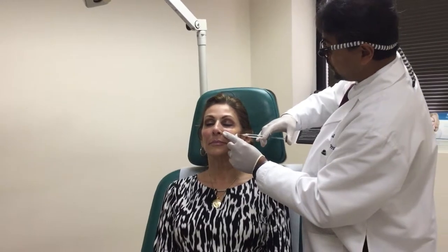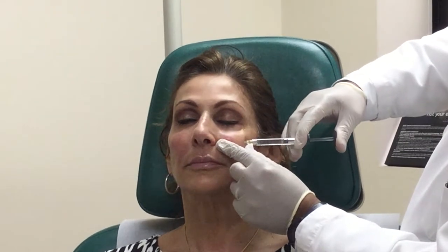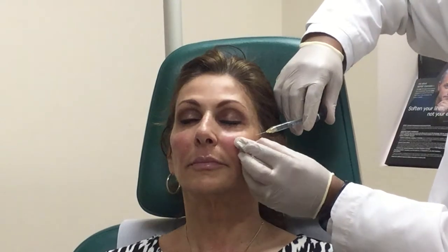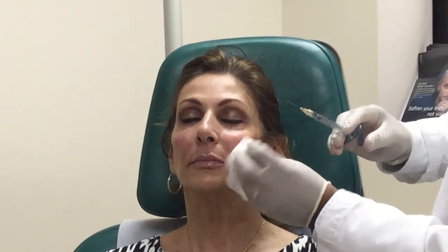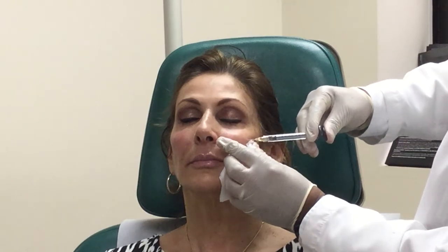Now we can go to the other side. It's obviously important to do the same thing on both sides, unless somebody's asymmetric to begin with — those are things you have to look at before you start injecting. Nobody wants an unhappy patient. On some people, the nasolabial fold is a little bit deeper on the left versus the right. Some people espouse the theory that's because when we're driving there's more sun exposure on our left side — sounds like a reasonable theory.